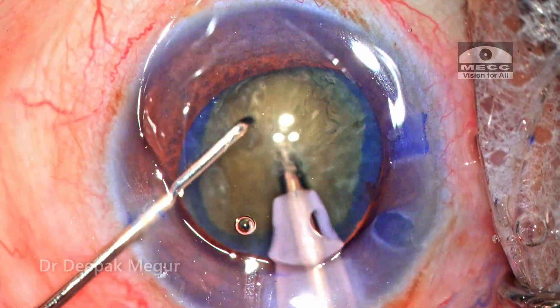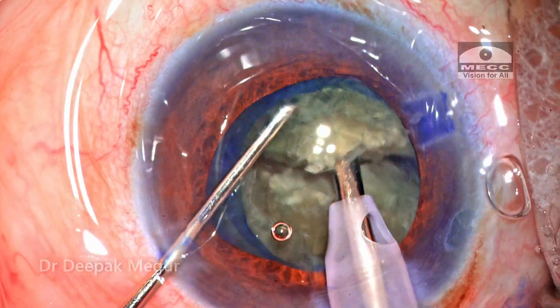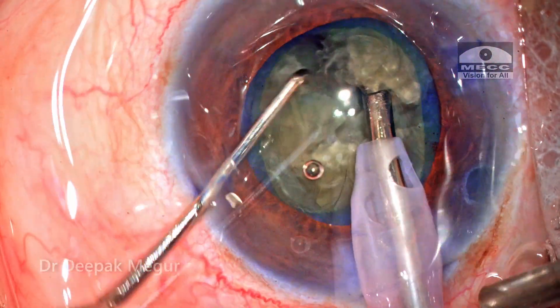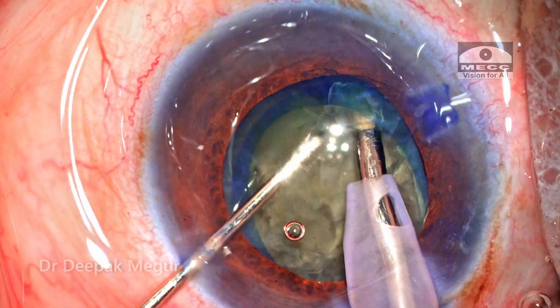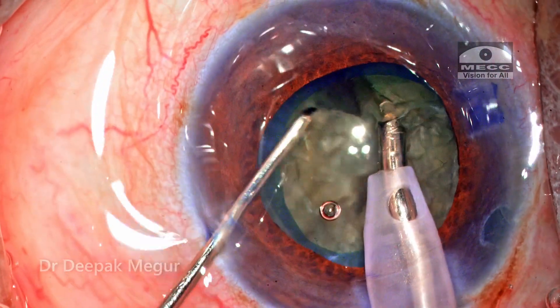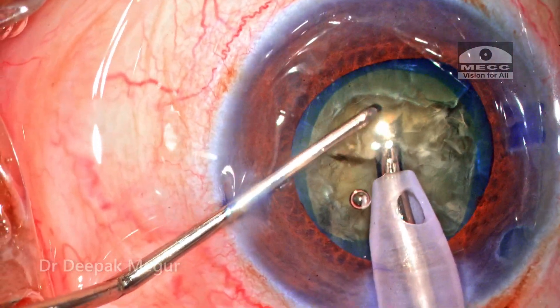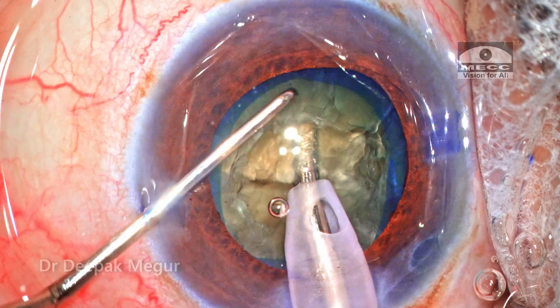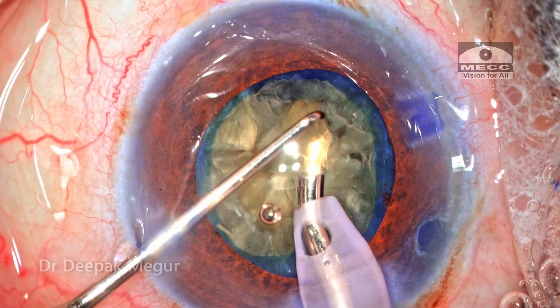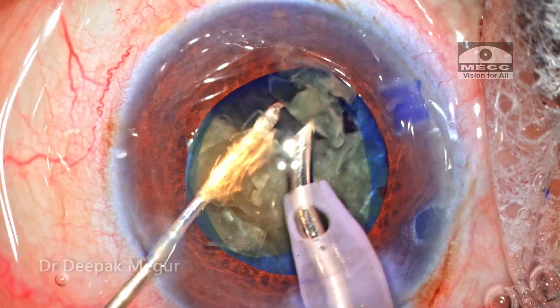Time to emulsify the nucleus. The standard vertical chop maneuver is being used to divide the nucleus into multiple small fragments — it is routine. Six smaller fragments are created and each one is emulsified in a very controlled manner. The plane of emulsification is at the level of the pupillary plane.